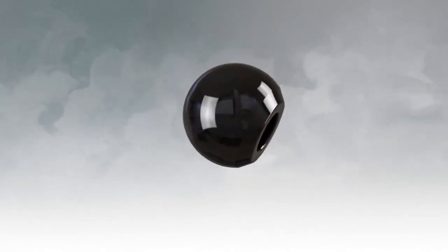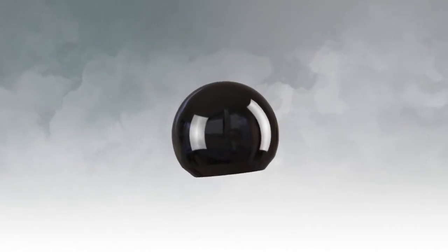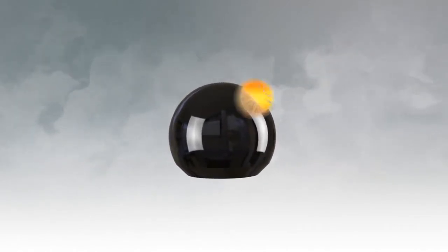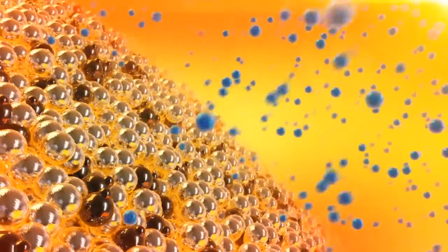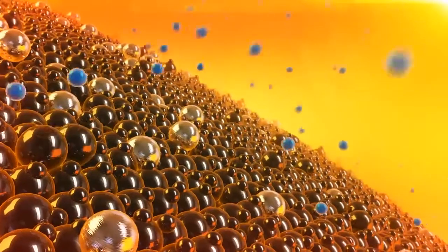The proprietary Oxinium alloy represents the first truly new material in hip and knee replacements in over 20 years. Unlike other implants, which are typically made from either a metal or ceramic material, Oxinium implants offer the benefits of both.